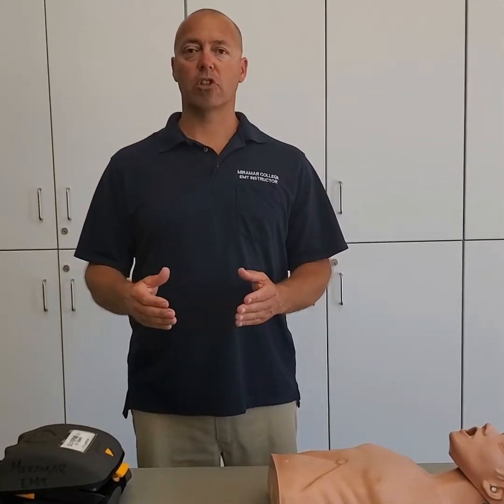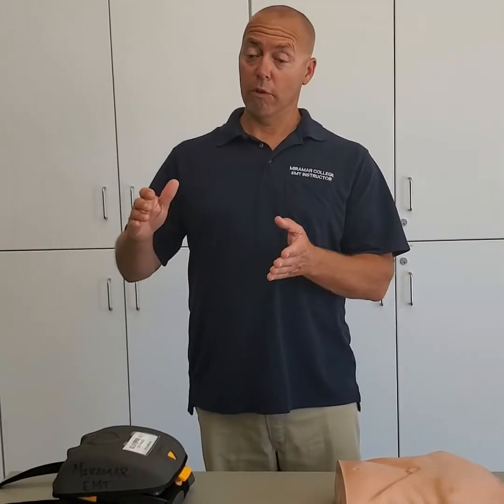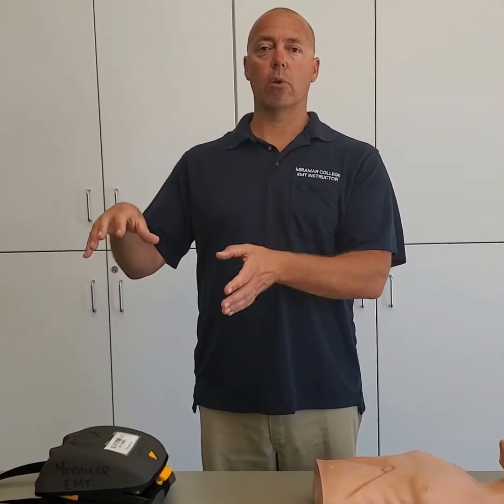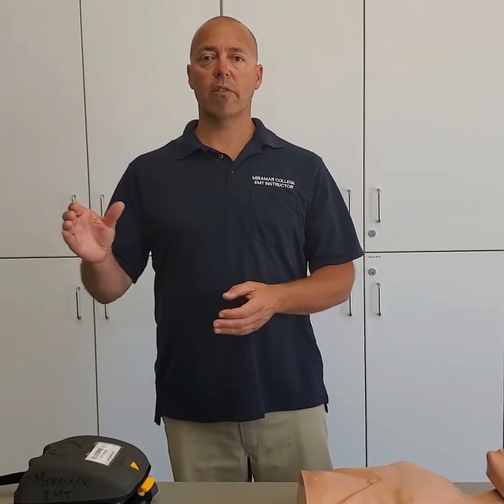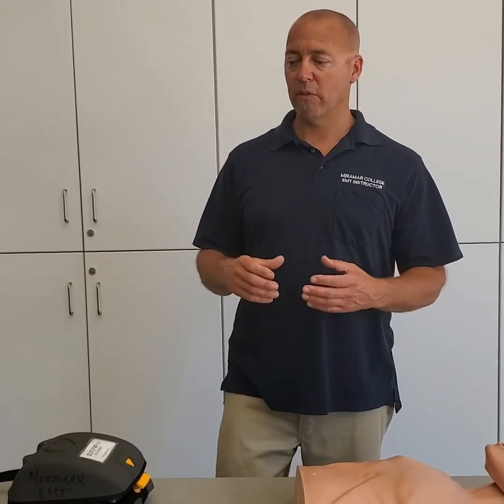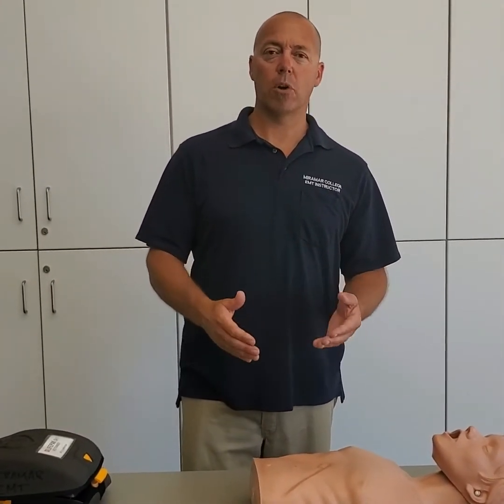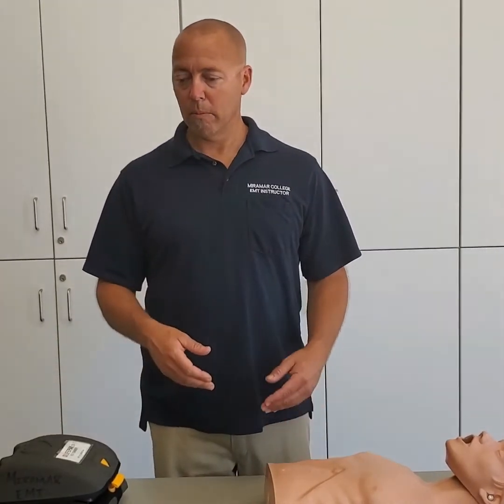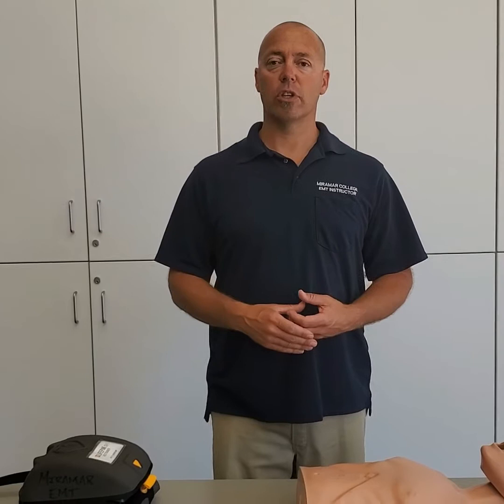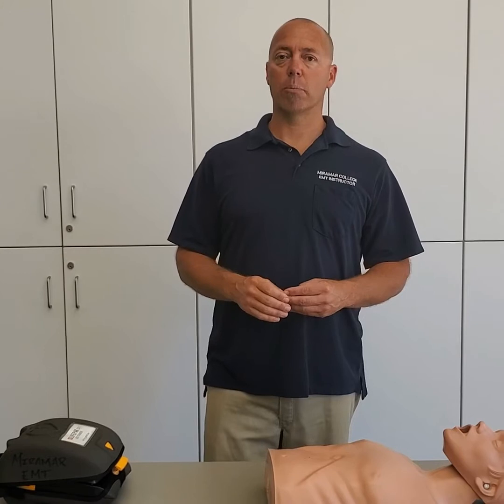We just make that distinction because we really have two different sizes of pads. We have the big pads and then we have the pediatric pads. If you're 8 years old or greater, you have to use the big pads. If you're 7 or less, you should be using the small pads. The small pads have a little device on them called a pediatric dose attenuator, which essentially just lowers the amount of electricity. They're smaller people, so they should get less electricity. So anybody 7 or less should get the pediatric pads.